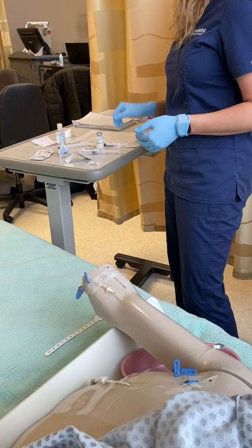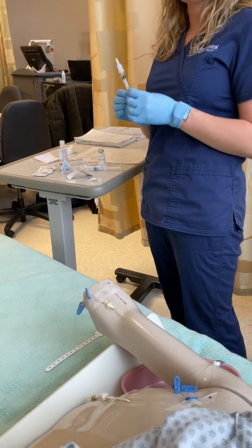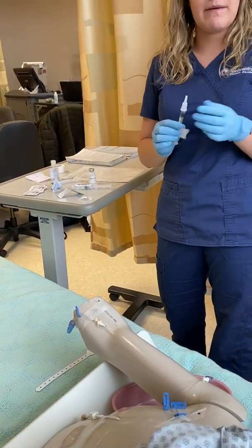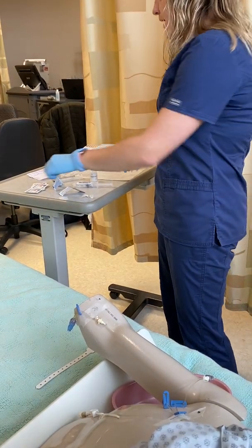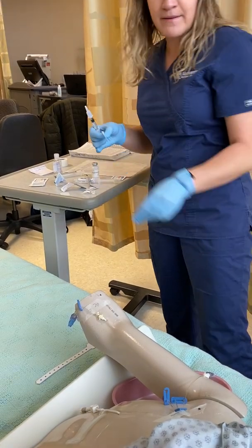I checked my Betty book to know that my medication does not need to be diluted and it is to be given over 2 to 3 minutes. Looking for signs of hypotension and respiratory distress. So I'm going to go ahead and clean my port.